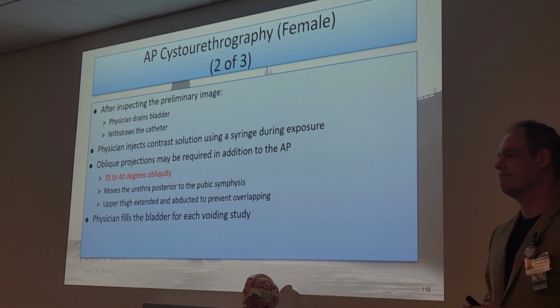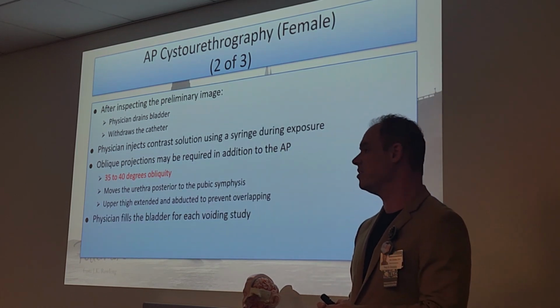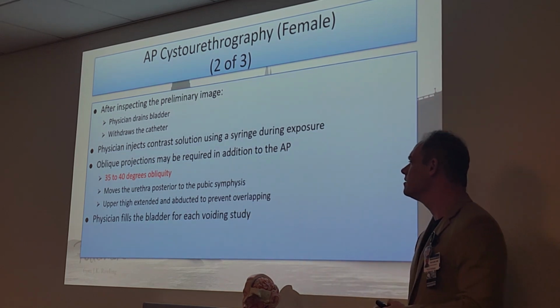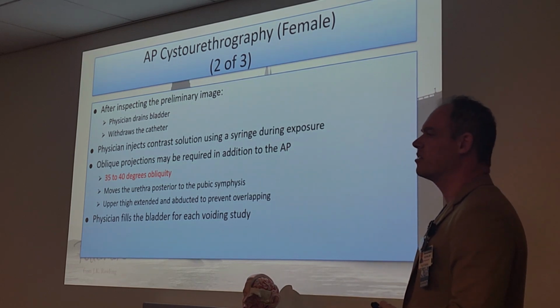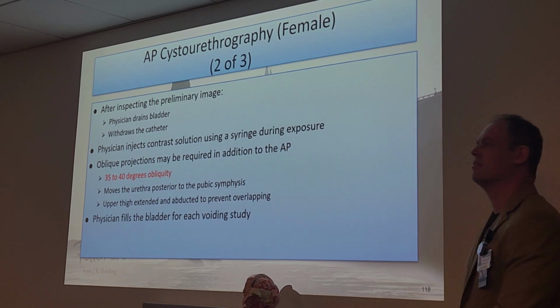And they were supposed to have an empty bladder before this? They should, yes. So they should urinate beforehand. Absolutely. Otherwise you have a bigger mess on your hands. Better cleaning up contrast than pee all over the table.